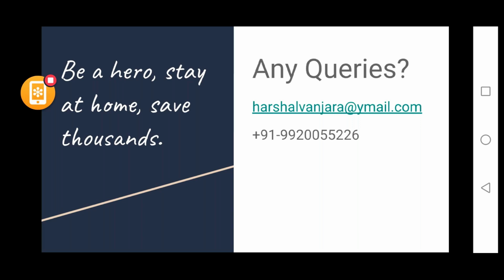Actually, sir, one of my friends did research on aberrometry based on VKC inducing keratoconus and the measurement of aberrometry. The spherical aberration was the most common. It's not showing any specific type of aberration, but it mostly showed spherical aberration.